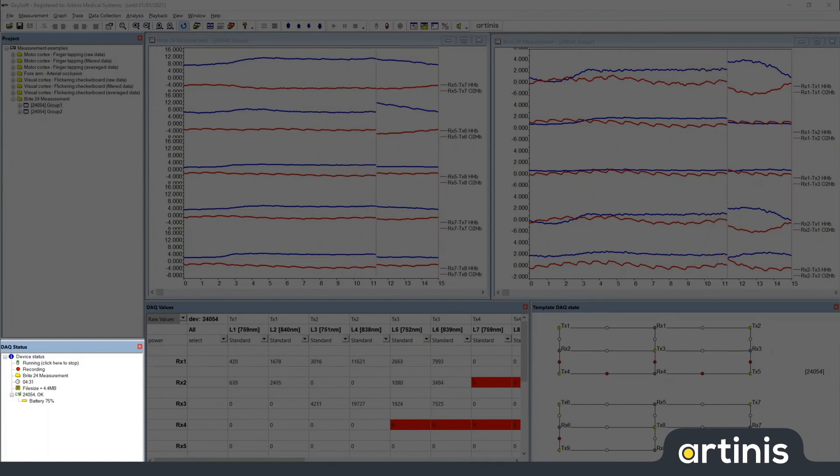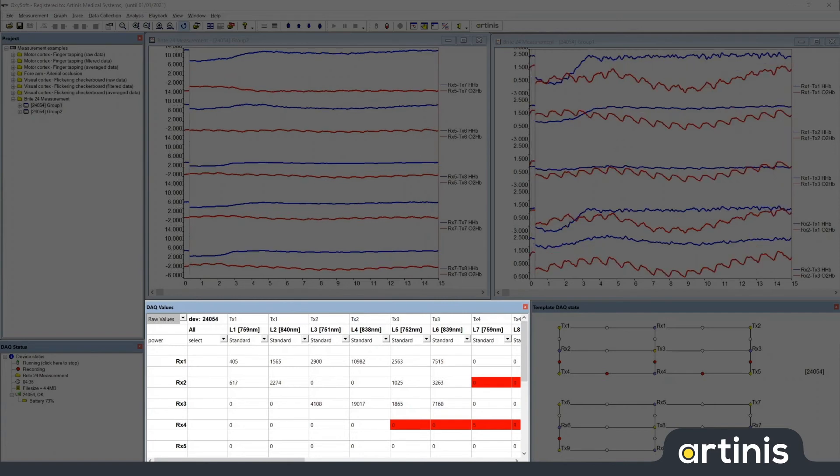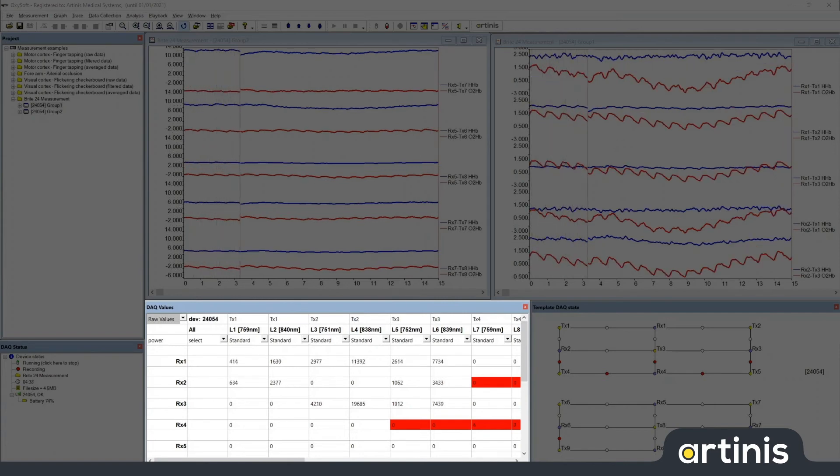To the right of that is the DAQ values window. This shows the light received at each receiver transmitter pair and it also shows in red if the light is out of range.